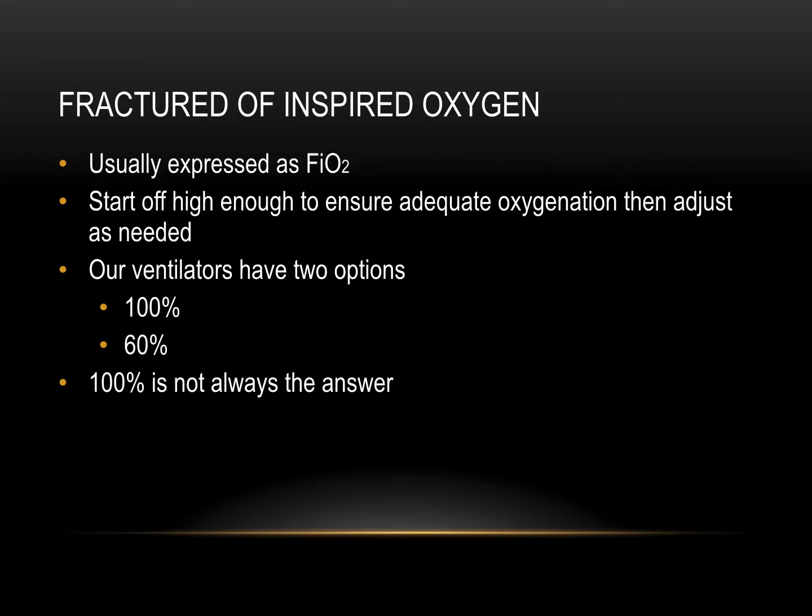Fraction of inspired oxygen. So FiO2. What is the concentration of oxygen that we're giving them? 0 to 100%, right? So we're going to start off with enough oxygen based on their needs. Our ventilators only have two options. By far the most limiting factor of our ventilator, we have an option of 60 or 100% FiO2. Just so you know, 100% is not always what we want to give these patients. Our COPD patients do not necessarily need 100%.